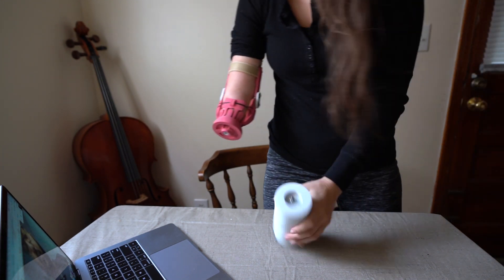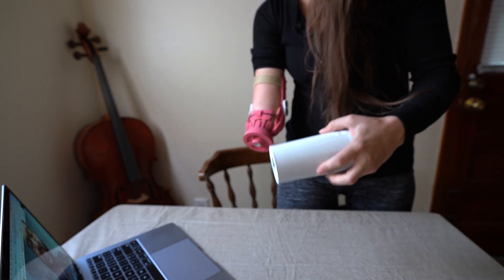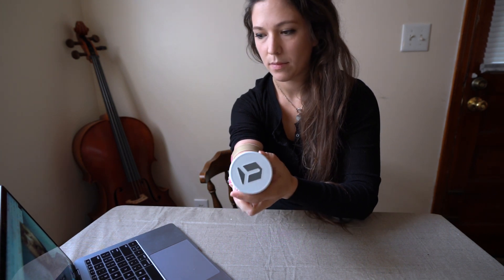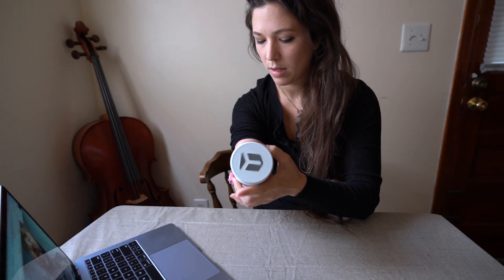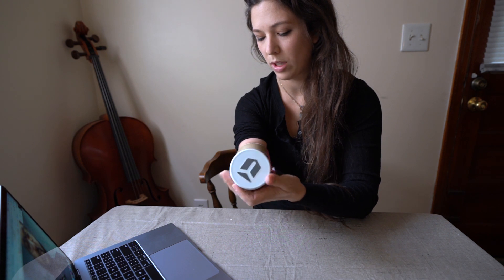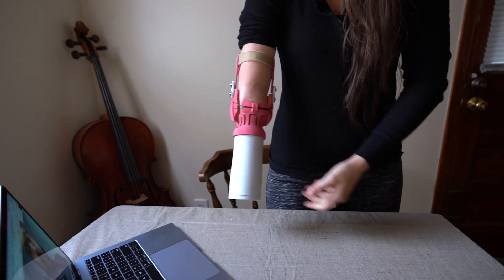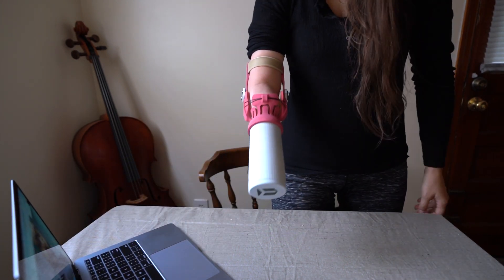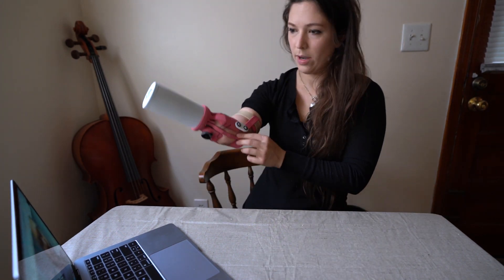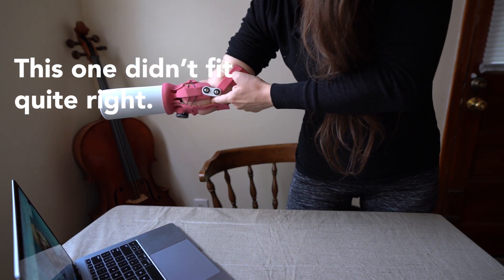Abby shows the test weight to viewers. She screws it on — it just needs to be finger tight so the two surfaces are touching. She jokes it could be used as a blunt weapon, but this is not what the arm is going to be. Standing with the weight attached, she notices her arm is definitely trying to slip out, and she can see how the contact area on the inside could chafe over time.